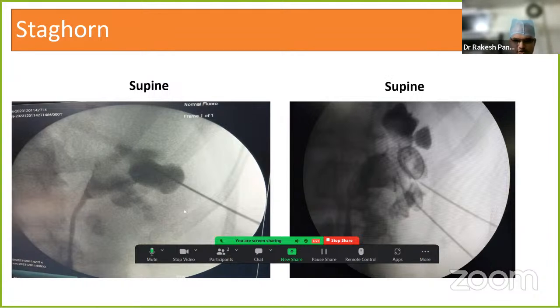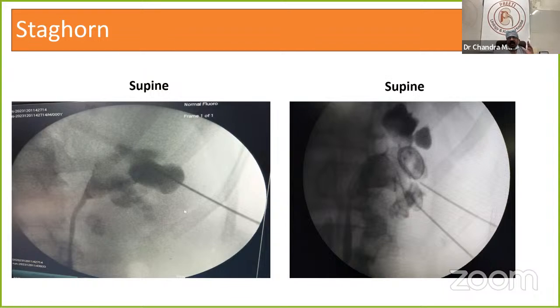For supine PCNL, the lower calyx is more high above the iliac crest, more lateral. It is good, easy. Otherwise, very difficult. Sometimes if we come more laterally and towards the thigh, we may puncture the colon also in supine PCNL. Correct, correct. So going above the posterior axillary line, we should not come so much anterior.